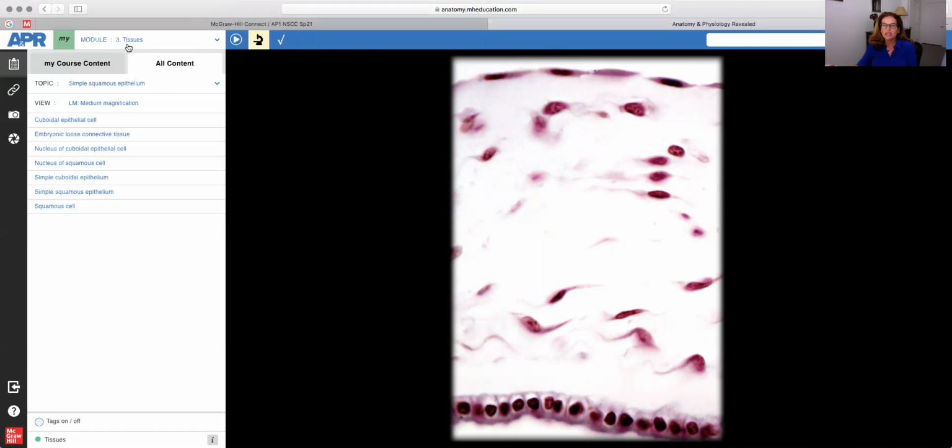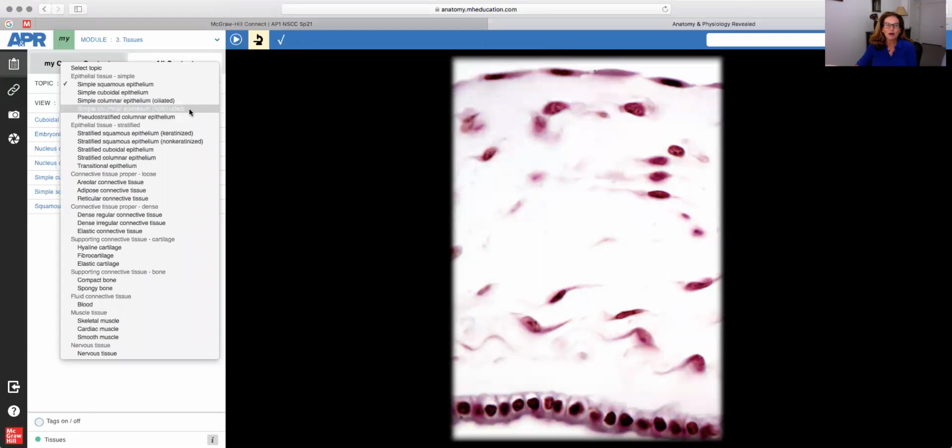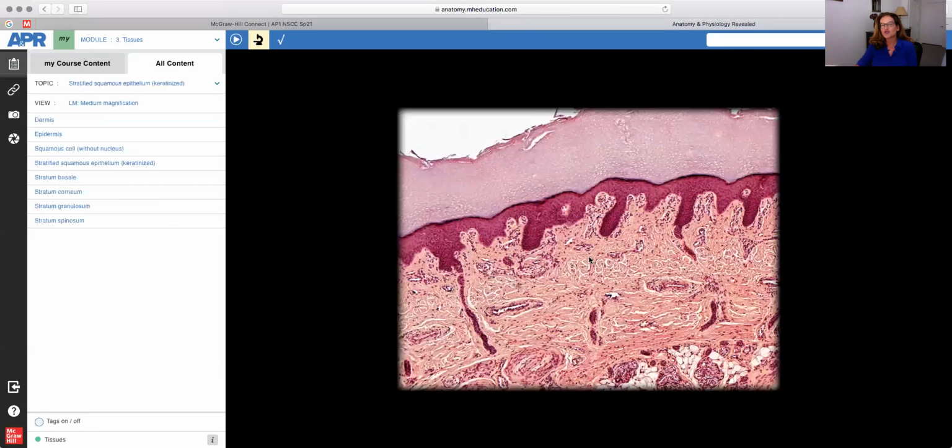Now let's take a look at many layers of squamous cells. So we would call them stratified squamous epithelia. And our skin is a wonderful example of a stratified squamous epithelia. Many, many layers. As you can see, hundreds of layers are making up our epidermis. So this is the epidermis right here, consisting of flat squamous epithelial cells. Below here is the dermis with connective tissue, tissue that we're not looking at this particular moment. That would be at another lecture.